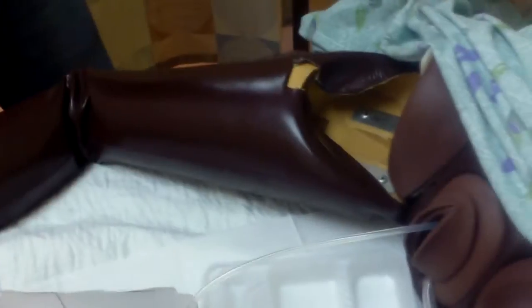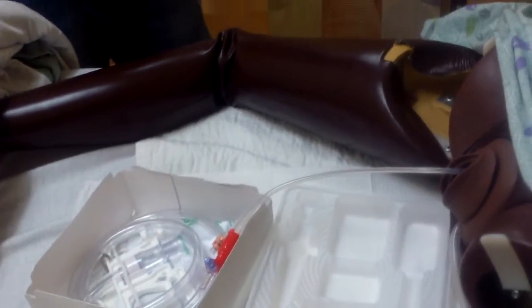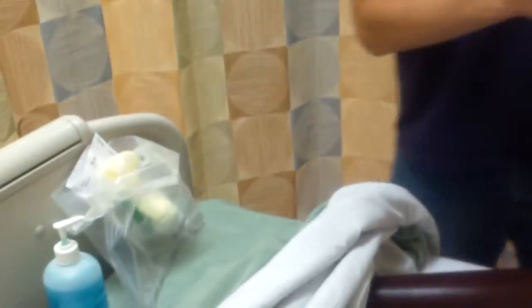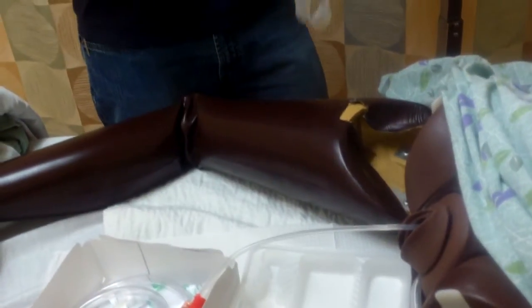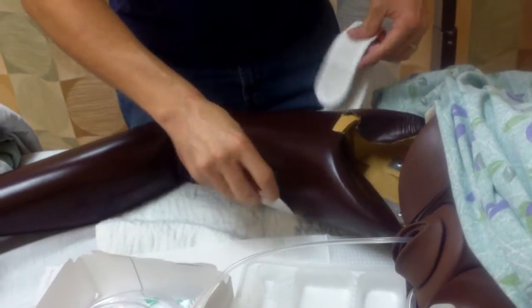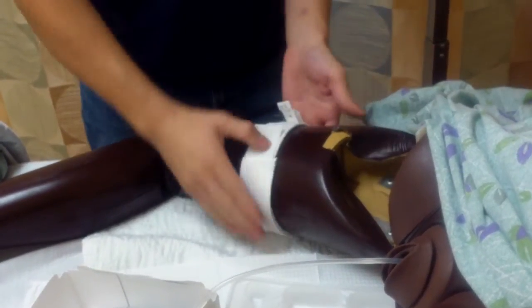I noted that. I'm then going to remove my gloves. Okay. Let's go into my bag. And hygiene. So now I need to apply the leg strap. So I have my leg strap here. Going to gently raise the leg. Okay. Put this around.